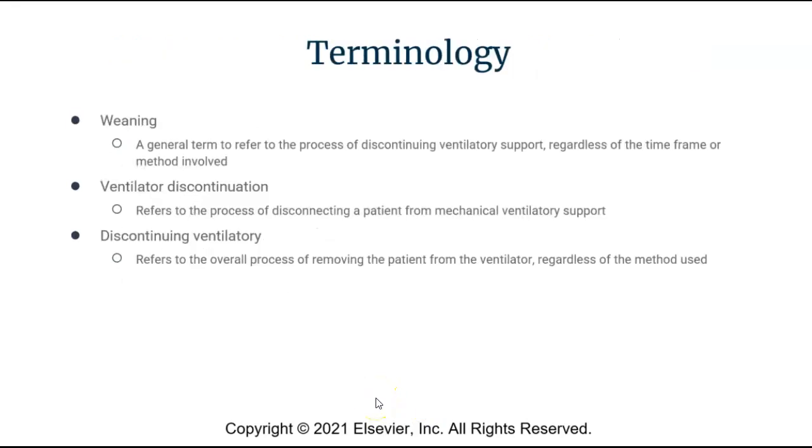Okay, some general terminology to talk about. Weaning is the general term to refer to the process of discontinuing vent support. Like I said, every day our patient should be weaning. It's not a specific time frame, and there's maybe not a general method involved, but when you're turning down any of the support mechanisms on the ventilator, you're technically weaning the patient.